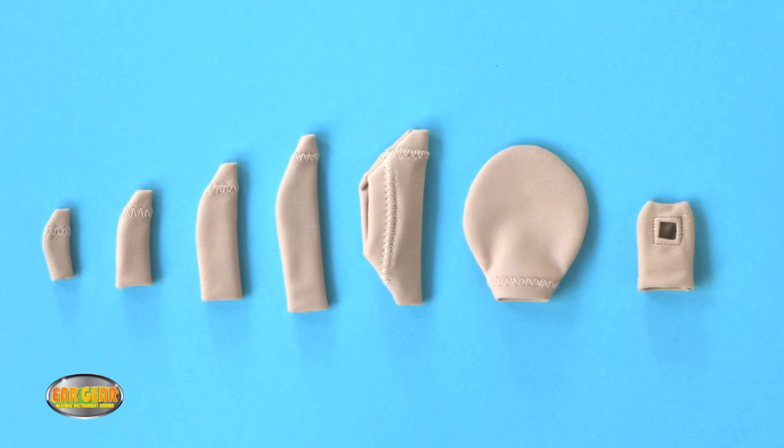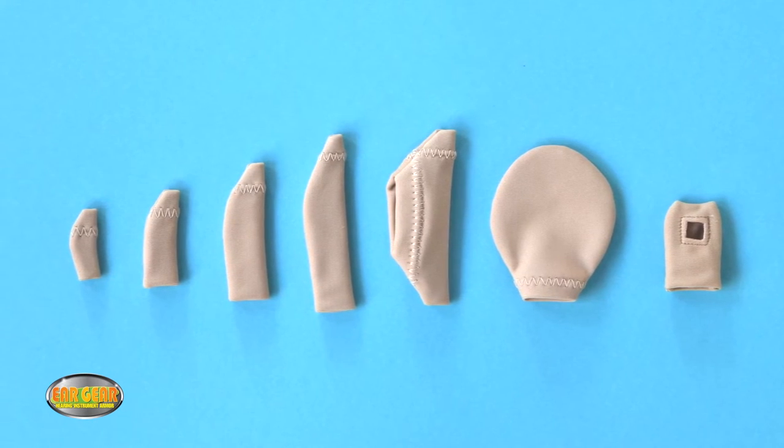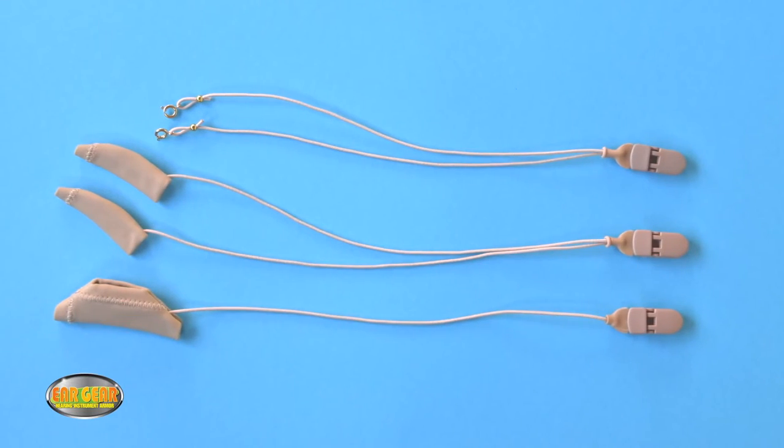Eargear is a spandex nylon sleeve that slides onto your hearing aid to protect it from sweat, dirt, moisture and wind noise. Eargear Corded also protects against loss.